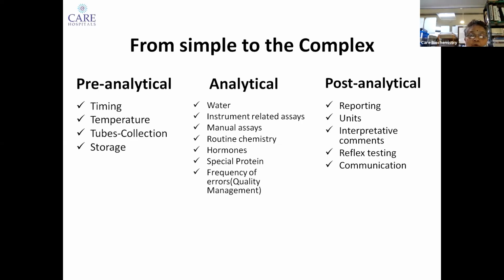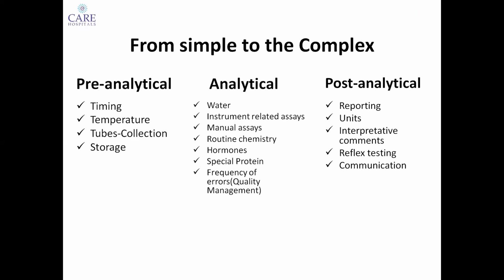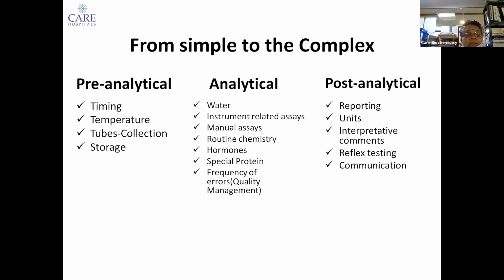And we also have a lot of courier services or standalone reference labs that we send our samples to. But are we all on the same page? Many a time, no, especially when it is a question of smaller towns or rural areas. And how do they transport or store these samples? So our issues start from this pre-analytical timing of these incidents. Then presuming that at least 80% of these things are in place, and there may be minor errors which may not affect the final analysis or reporting, we go to what we look after.